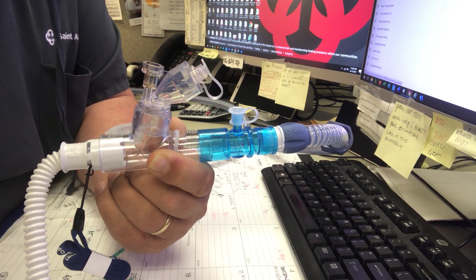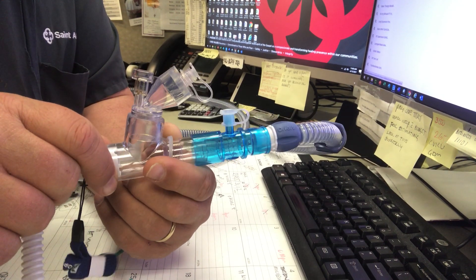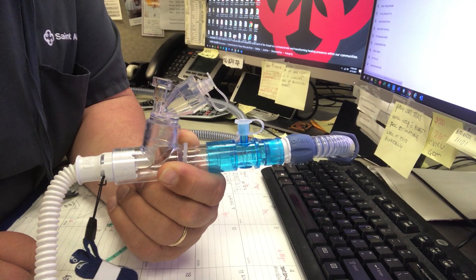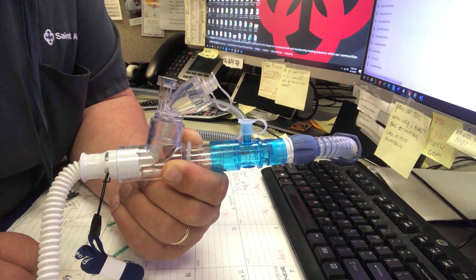But that is quite simply how you put it together. This has to remain up — you don't want it tipping. So you do have to be mindful of where you position that. But that's how you set up an Aerogen device for an Airvo high-flow system.